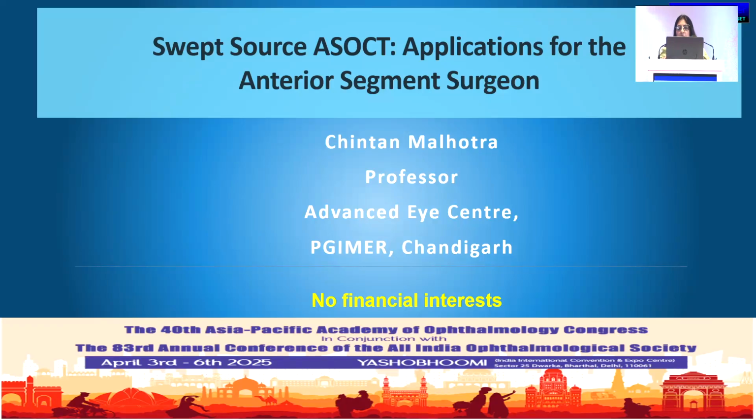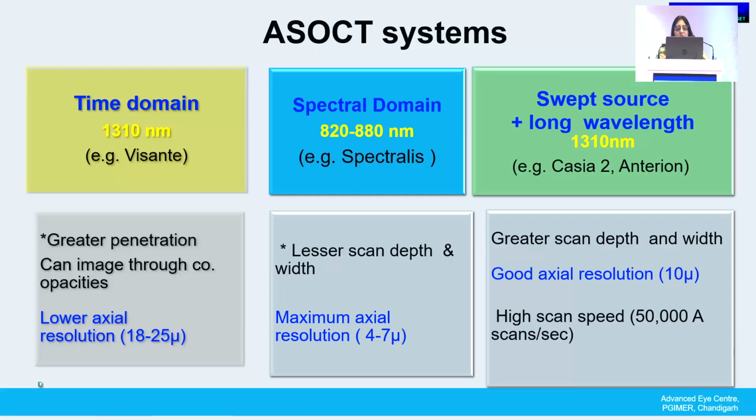What I'll be speaking about over the next 10-12 minutes is about the swept source OCT and how it can help us as anterior segment surgeons. If we go to the AS-OCT systems, there are different technologies available. We have the time domain, the spectral domain, and the swept source OCTs. Each of these have different properties.